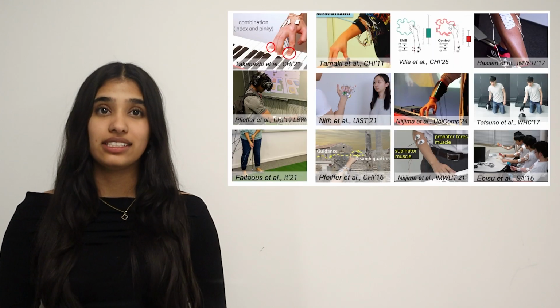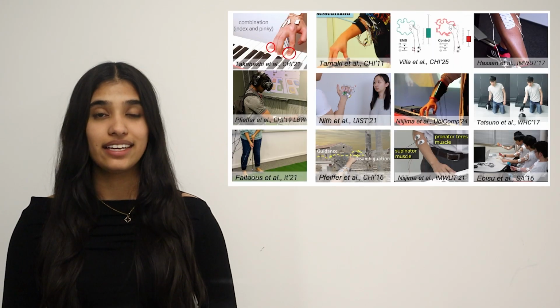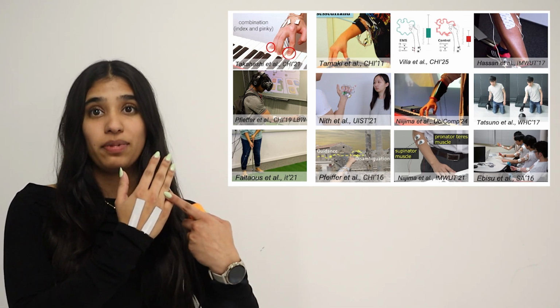Even in the midst of advanced interactive technologies today, like videos or interactive tutorials, acquiring muscle memory with a new physical skill is still something we do mostly by watching and copying movements. However, in the past years, we've had the emergence of electrical muscle stimulation in HCI. Muscle stimulation is a technique that sends small electrical impulses to the muscle to move users' bodies.